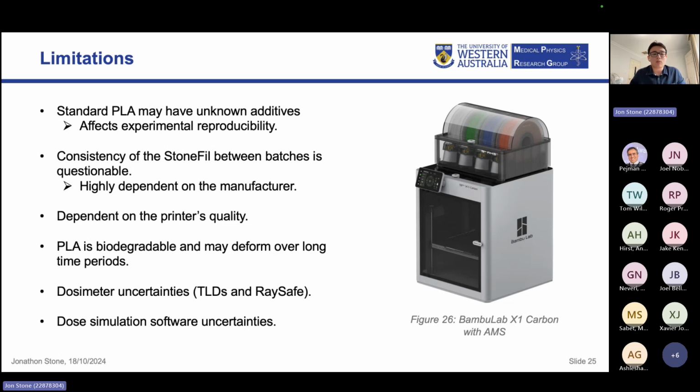The phantom is also highly dependent on the printer's quality. So for example, if the printer is not serviced properly, or if the print settings are wrong, then we can also decrease the quality of our print, which decreases the phantom's quality.